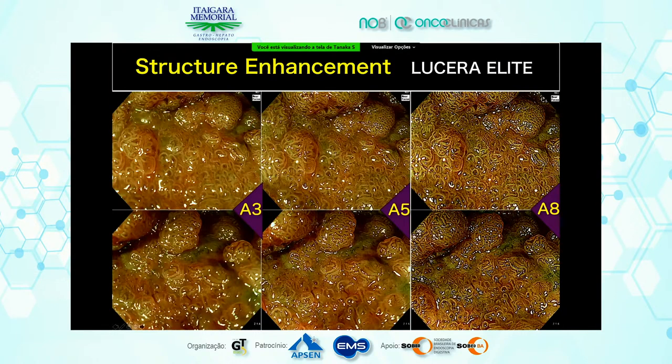Also, to observe surface pattern in NBI magnification, the setup of structure enhancement of the system is very, very important.